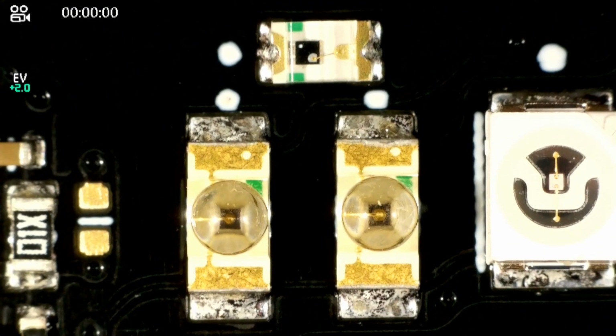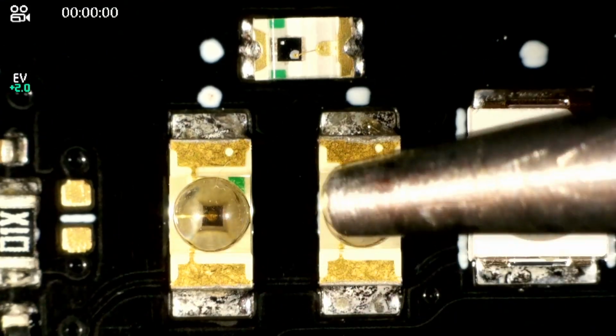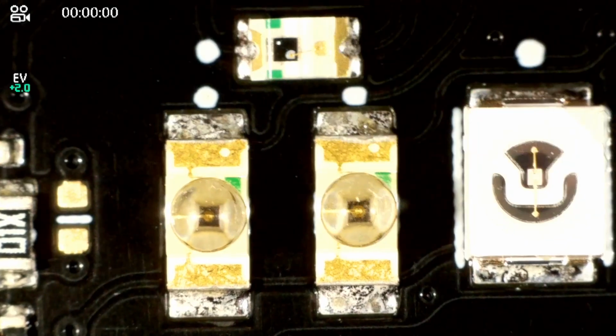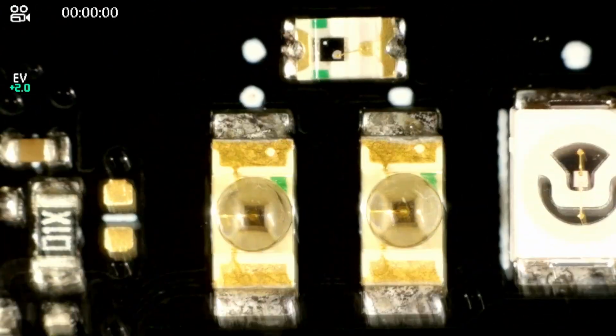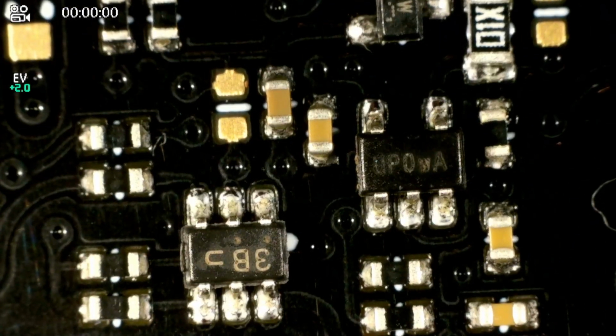That's my guess there. And if you go further, we see a trio of components again. So we have two transmitters here, these are two LEDs, and a detector, and I think this is what's actually reading the final result. But please correct me if you know otherwise. A bunch of other passives, most likely just transistors, things to turn on and off the LEDs and so on, and here's the pads for the battery.